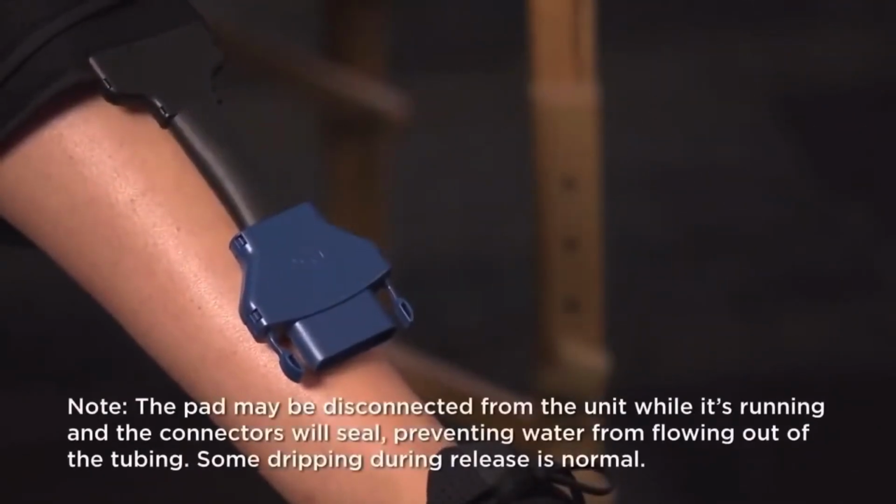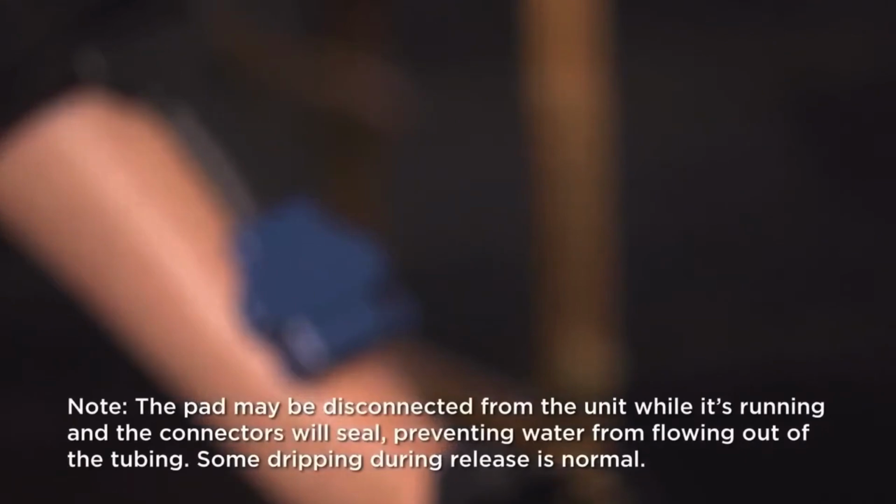The pad may be disconnected from the unit while it's running, and the connectors will seal, preventing water from flowing out of the tubing. Some dripping during release is normal.